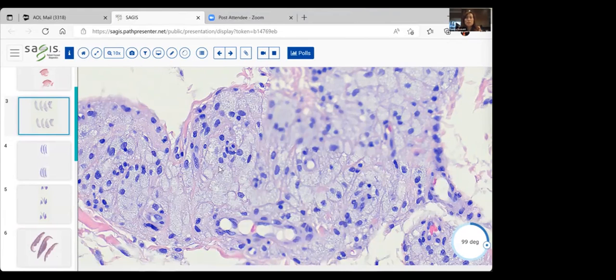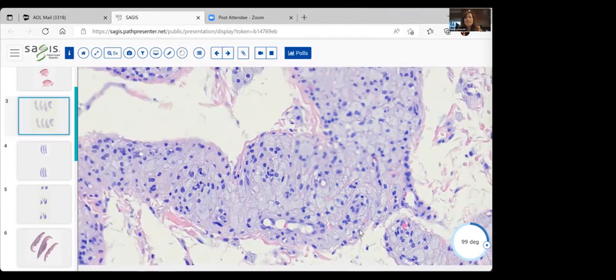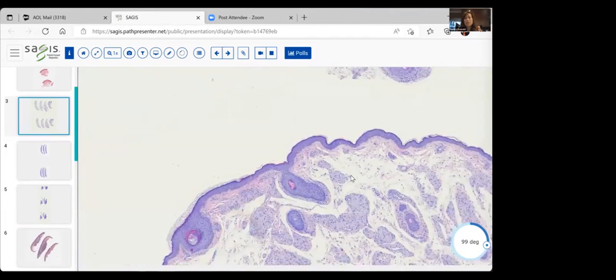very superficial but thin dermal plaques located either unilateral or more commonly symmetric in the eyelid tissue. And this is called xanthelasma. Foam cells in xanthelasma may indicate a lipid abnormality, but most of you know that 50% of patients presenting with xanthelasma are normolipemic. Perhaps the younger individuals with xanthelasma may have a higher incidence of having lipid abnormality. So this is an example of histiocytes, which are lipid-laden, making foam cells or xanthoma cells, in this case, a xanthelasma. A very, very nice example.